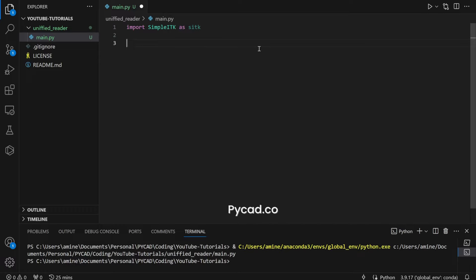We will have two types of functions. One is the reader — how to read the DICOM series and combine them into one 3D file — and another for NIfTI and NRD. We also have a function that extracts the 3D numpy array and the metadata. We start with the extraction function because the readers will depend on it: whenever we read DICOMs or NIfTI or NRD, we will call this same function to do the extraction.